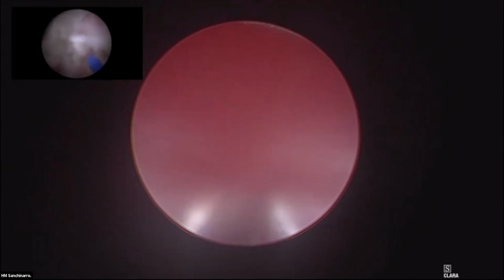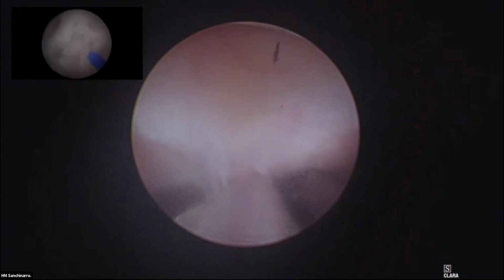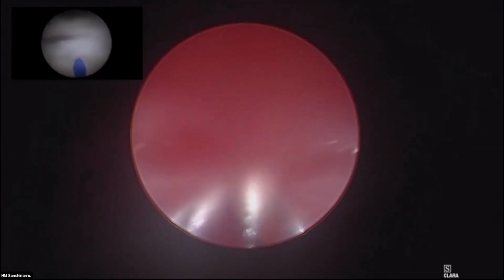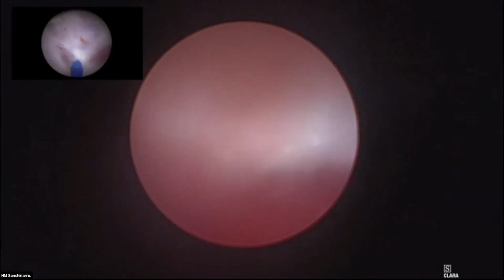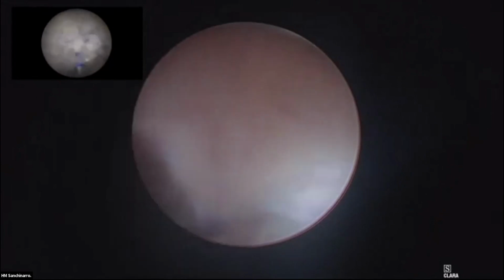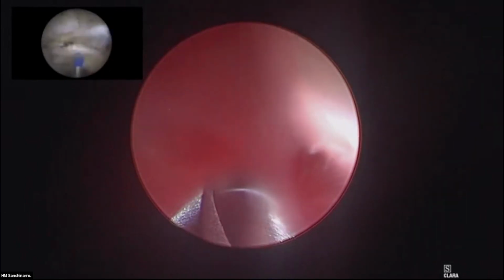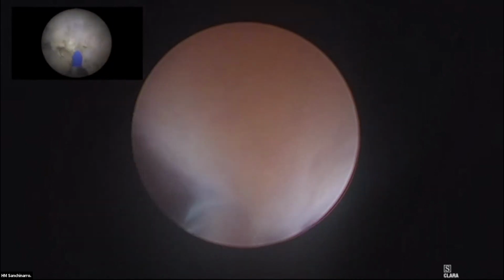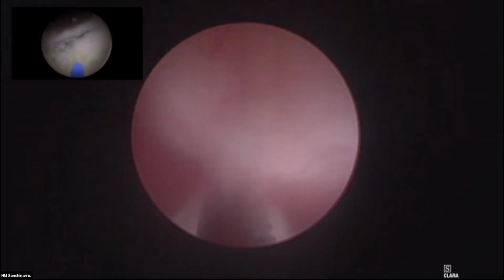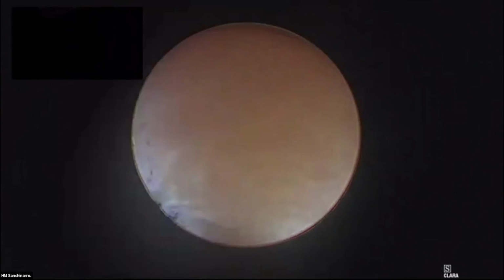Do you like to perform the final morcellation even into the prostatic lodge? In the fossa, or only if the pieces are escaping too much, and I need to keep it in the right position, and it seems that I have to. You prefer to do it in the bladder always? Because for me, as soon as I can, I put the adenoma in the fossa. Yeah, always. With these morcellators, you don't make any injury in the bladder, and you perform it quicker, faster, because usually you don't lose the adenoma that much. Yeah, you have to put the blades a little bit harder.